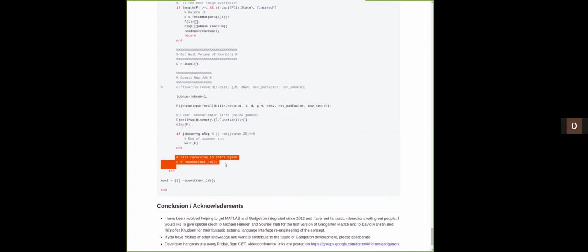And then we use tail recursion, which was the first time I've used this since learning about it 20 or 30 years ago, to do something with the same function. And what it does, and we come back to the beginning of the function now, it looks to see if any of the previous parallel processes have finished, and if so, there's our D, which gets returned.